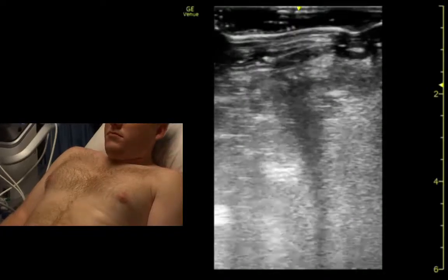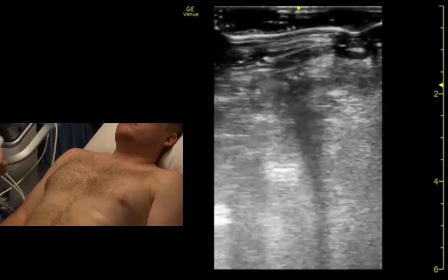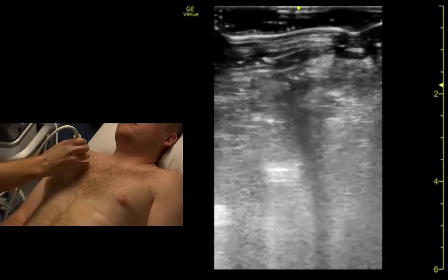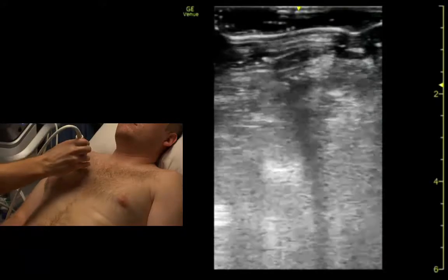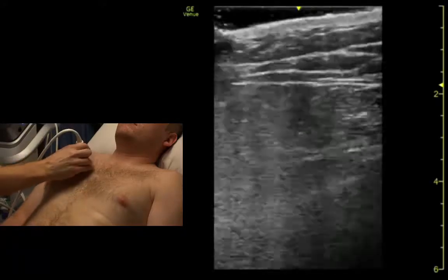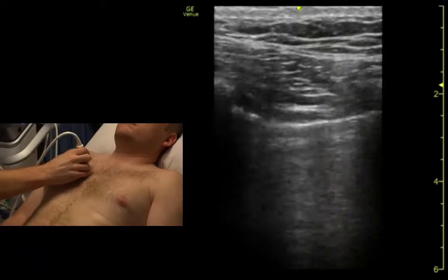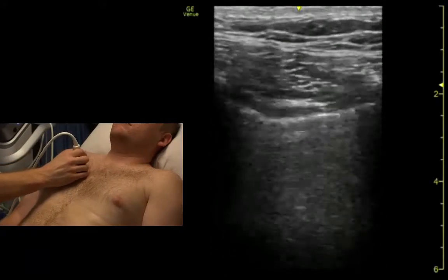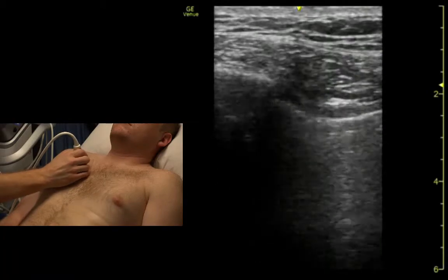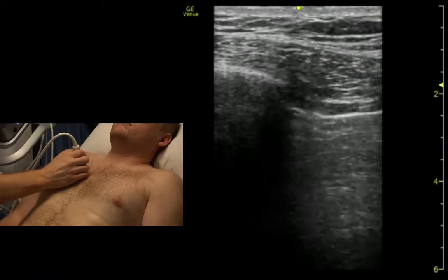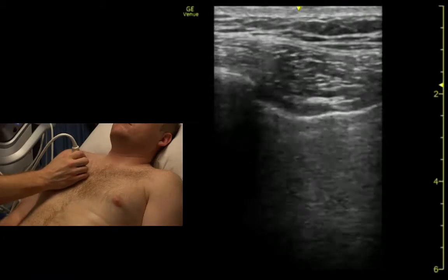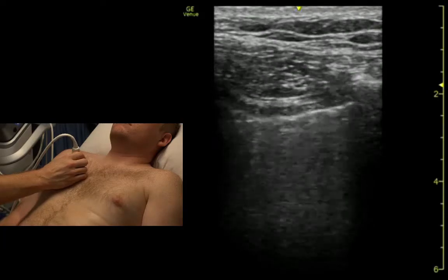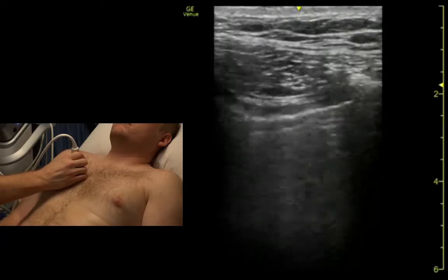With the chest, I'm using the linear transducer. For now, I'm looking at superficial things. I'm going to come in about the second or third intercostal space. I'm in this chest setting, so the resolution doesn't look very good, but it's meant to make lung pathology stand out.